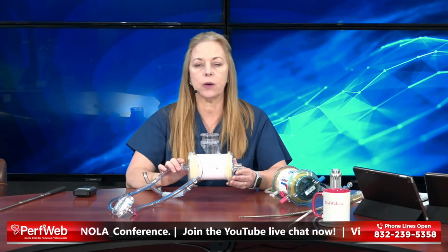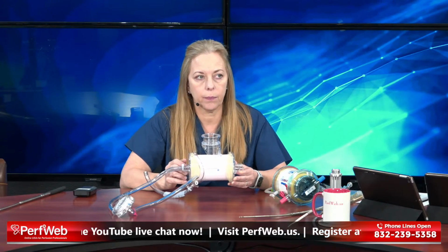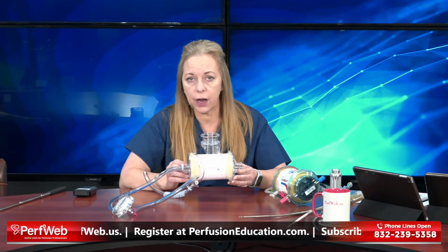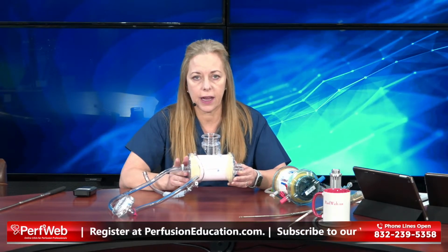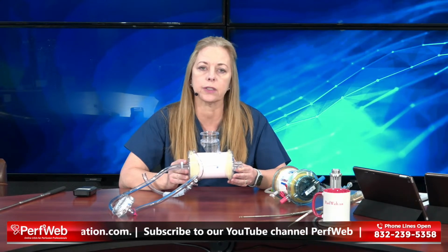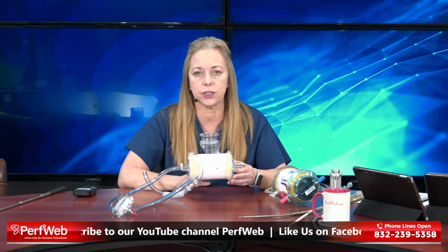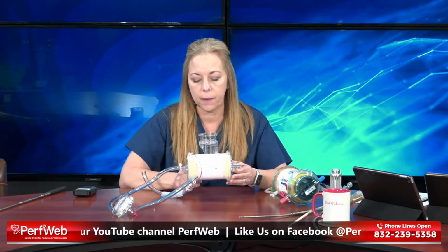You do need to be aware that because it's polypropylene, it will interact with lipids. So with propofol, you would want to have an alternate medication on these patients. Now, a little bit of propofol and then turning it off while you're switching, that's okay. It's not that you can't use it at all if the patient has some propofol going. Just know it's going to affect the longevity of the oxygenator and its performance.